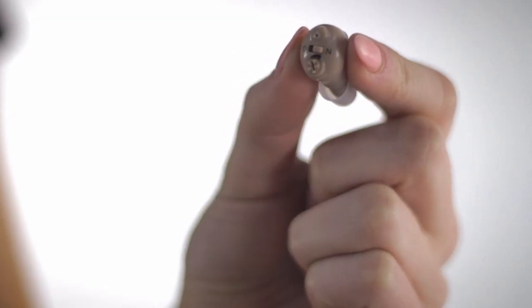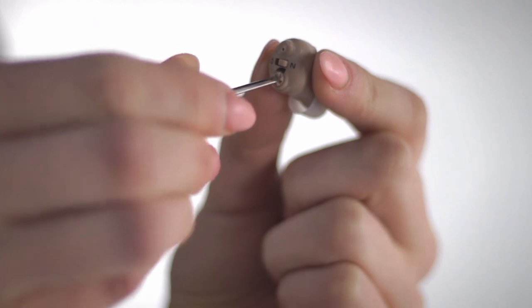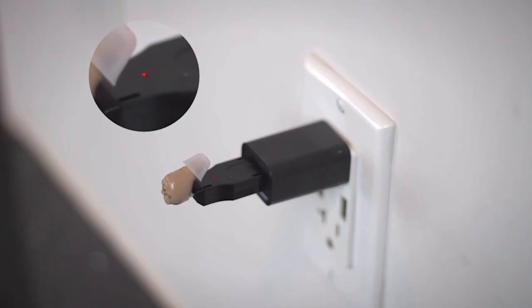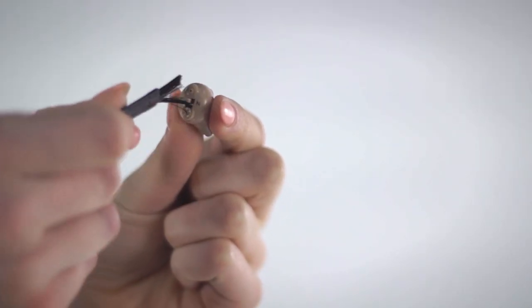Why is my device so quiet? The volume setting on the hearing device is too low. The battery is low. The earpiece is clogged or dirty. The microphone is clogged or dirty.